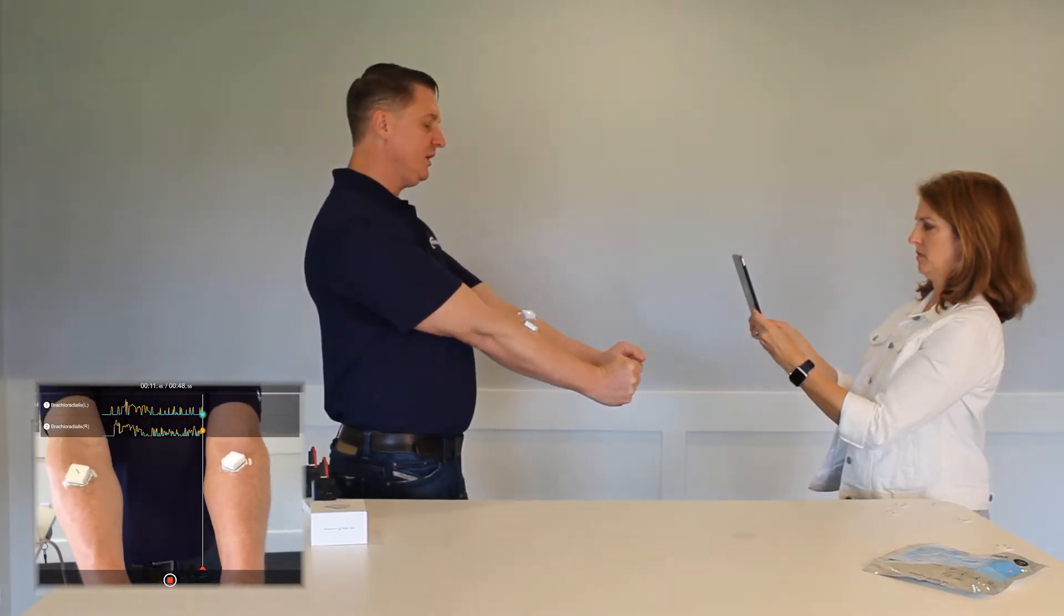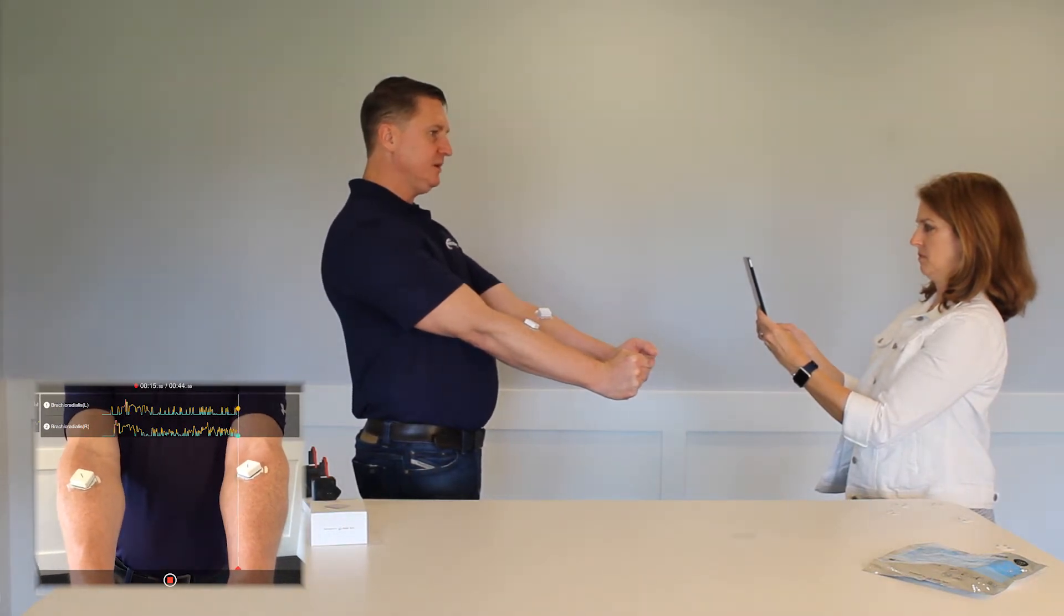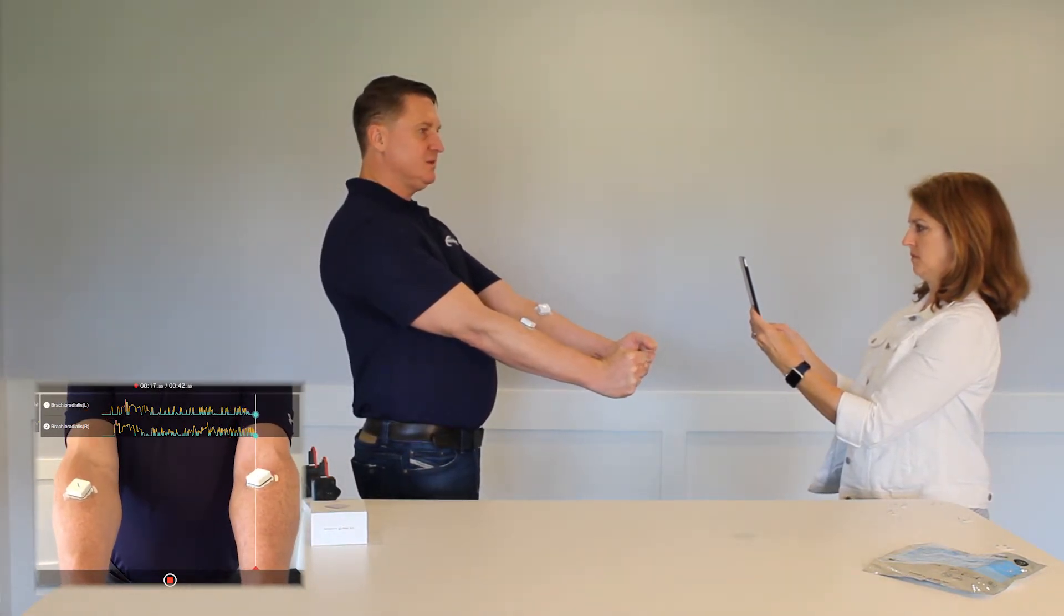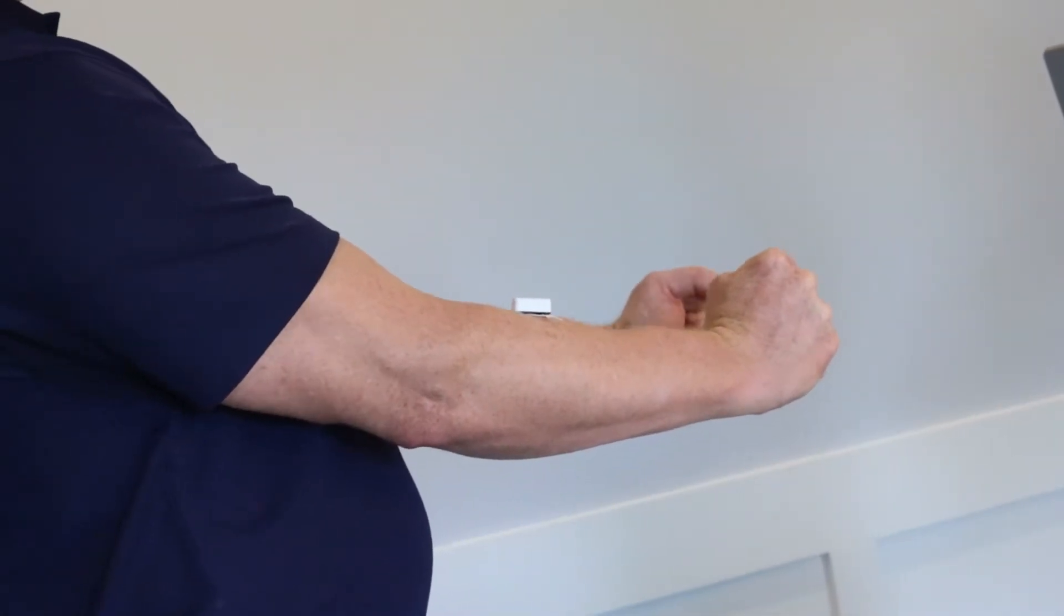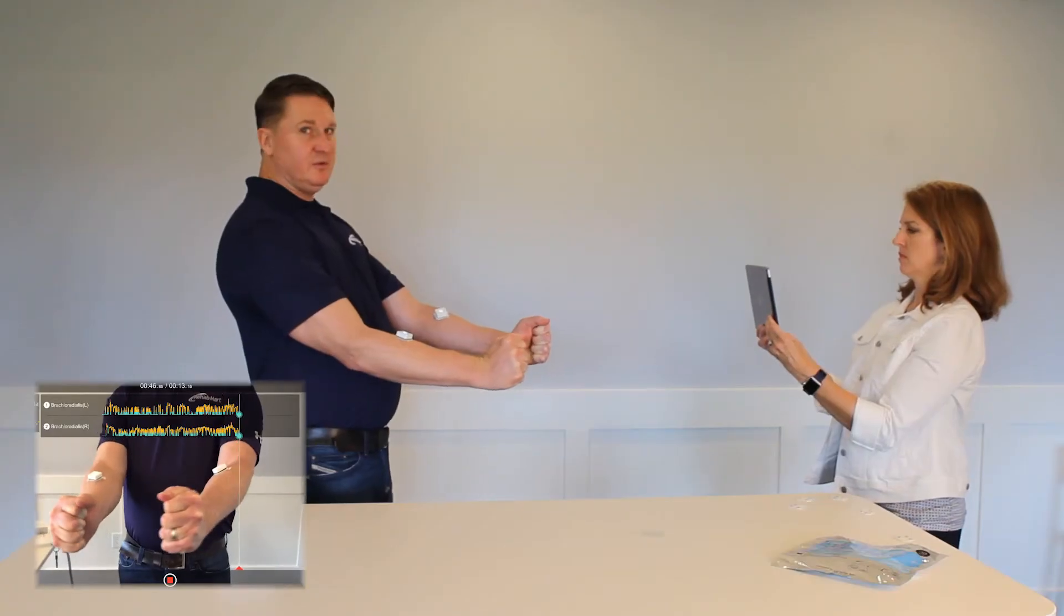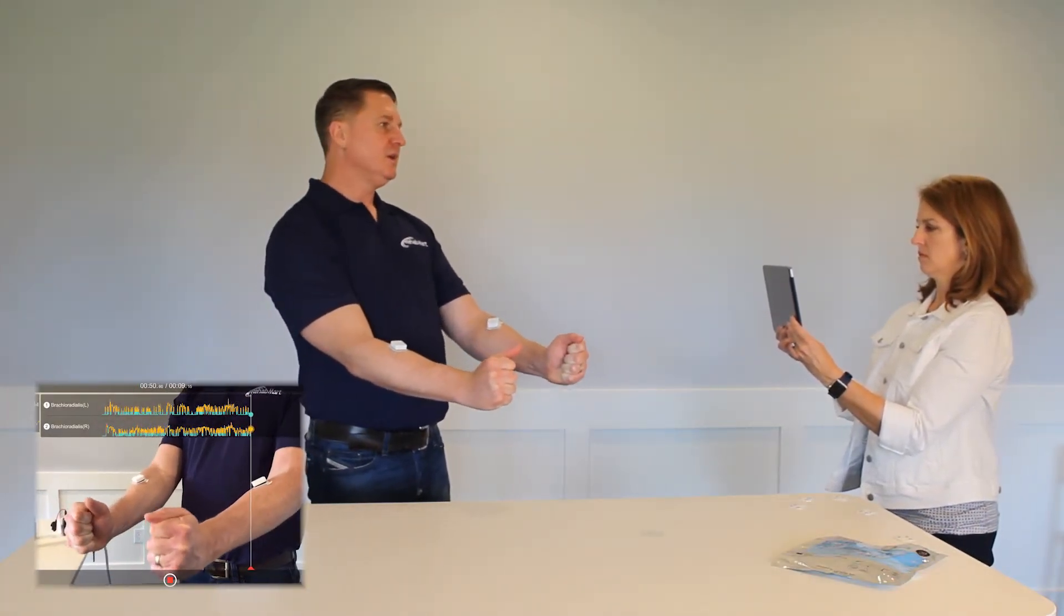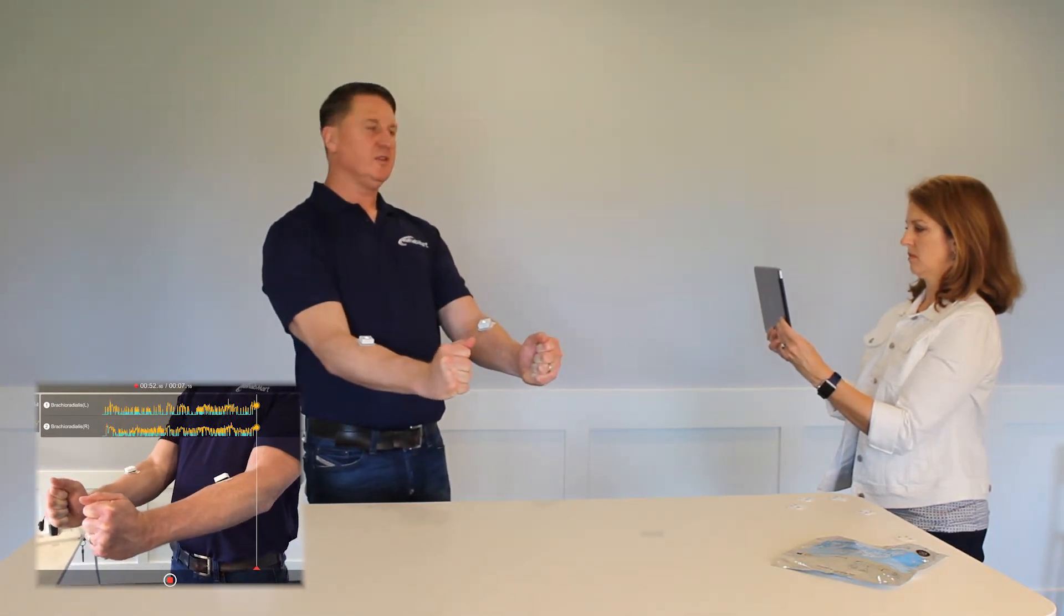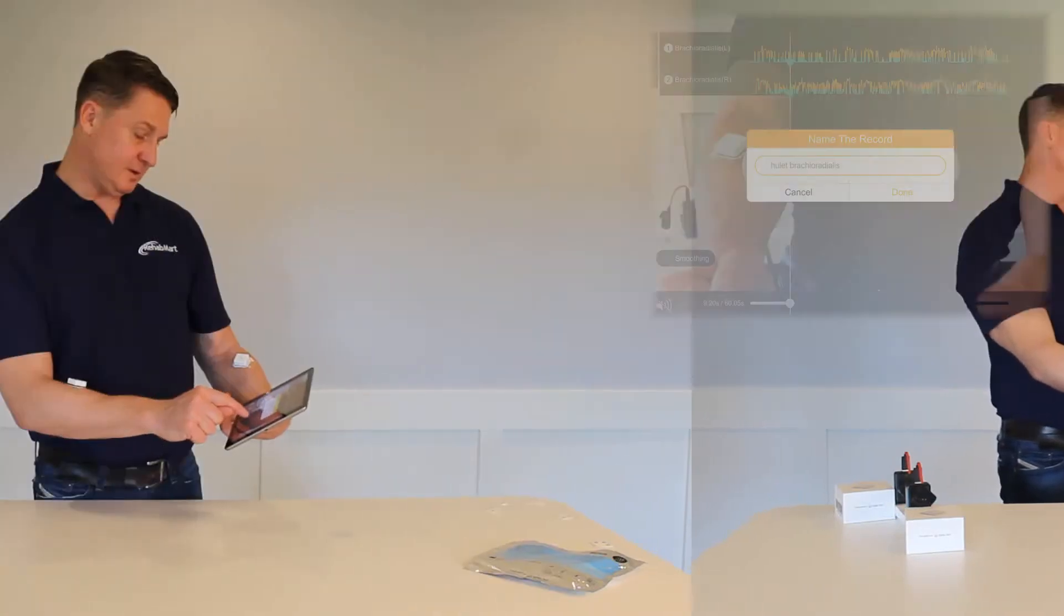The nice thing about the recording option is that you can actually see what the patient is doing. You can have a patient sit down, stand up. You can see their face, how hard they are working. The downside to the video recording is that the patient doesn't really get to see the graph in real time. Only Megan is seeing the graph in real time. And done. Just loading the record.